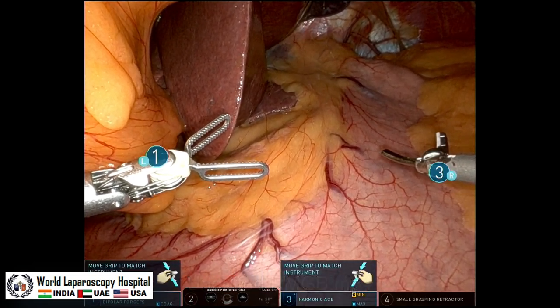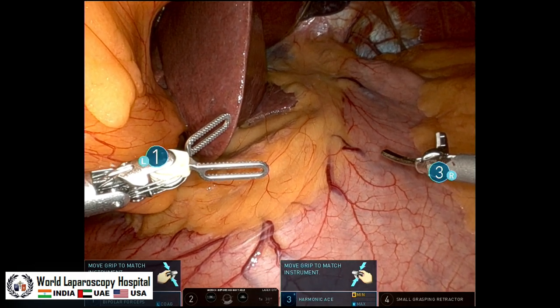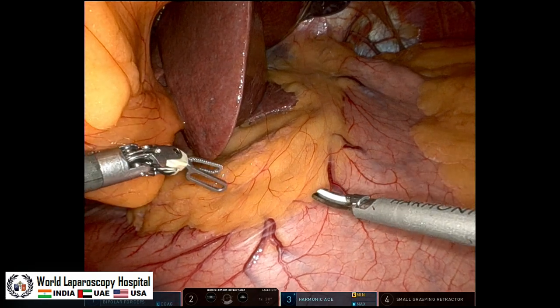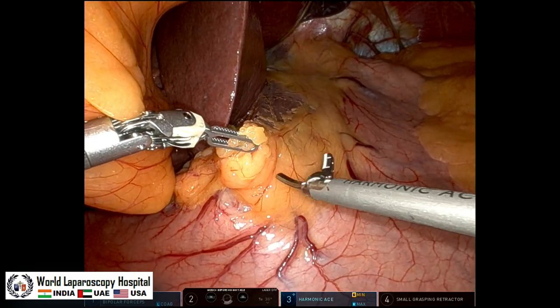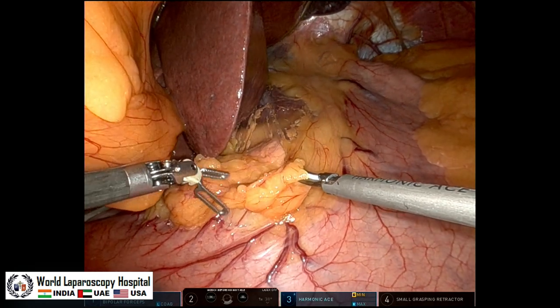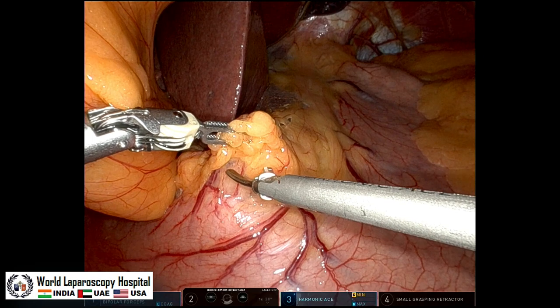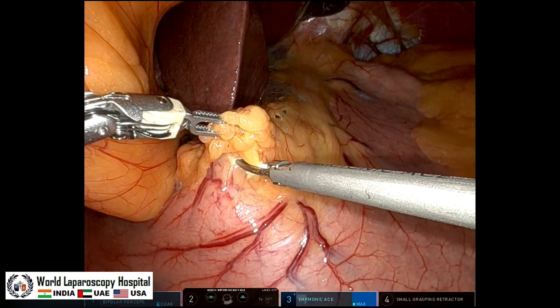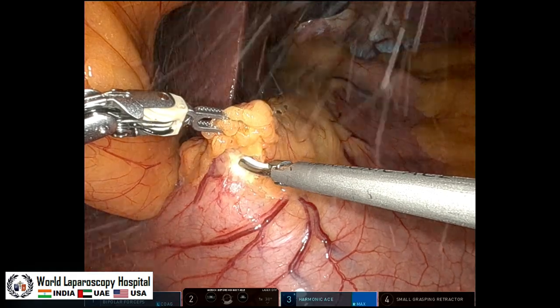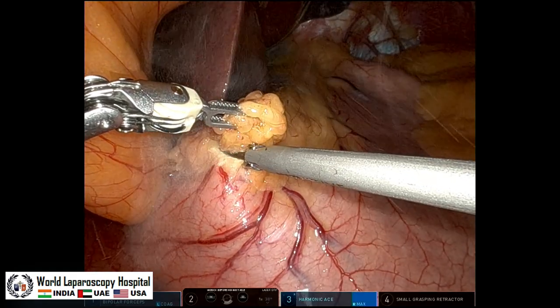So that's the end of the surgery and after that, we do the leak test. And as I told you previously, this is an unedited real-time video and the total time, if anybody was observing, is 19 minutes for this surgery from beginning to end. So it's not very complicated. It depends upon the practice and the use of newer techniques. You should always adapt to changes. Thank you very much.